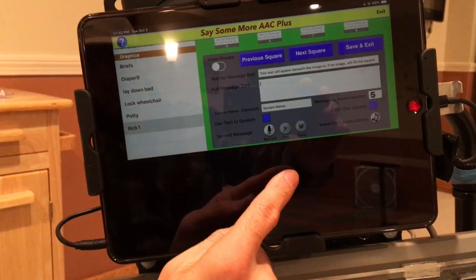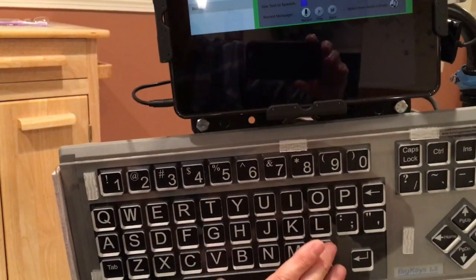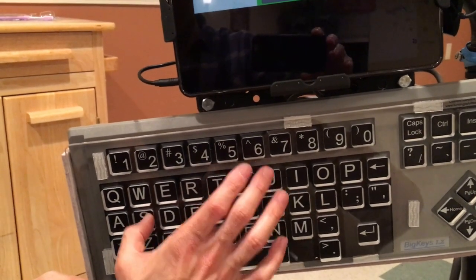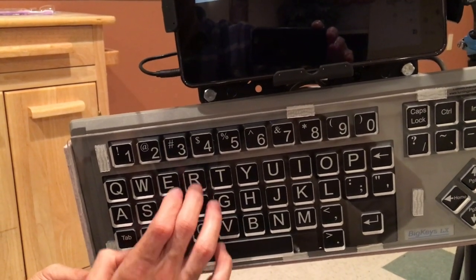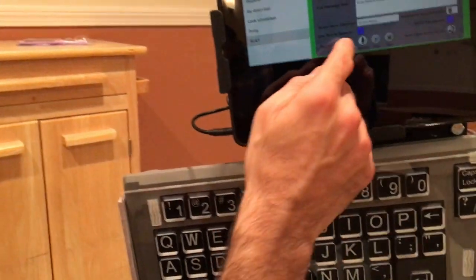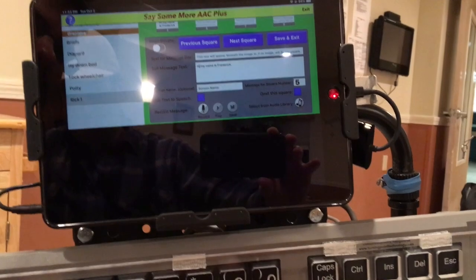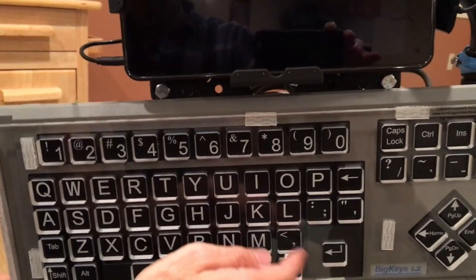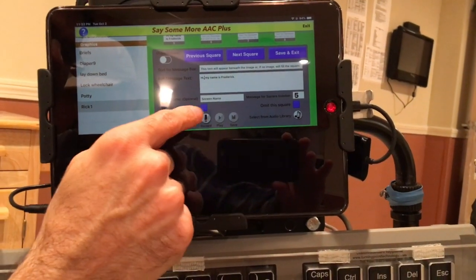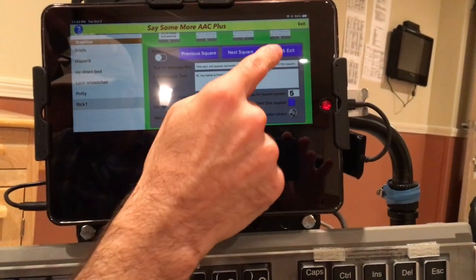And so now we can click here, and we're gonna say, hi, my name is Frederick. You can also give some spacing in the talk. If you put a comma, it'll have a little bit of a pause. It'll sound a little bit more natural, like, hi, my name is Frederick. This has a little pause there. Okay, so then we need to check this here, use text to speech, like that. And now we go save and exit.